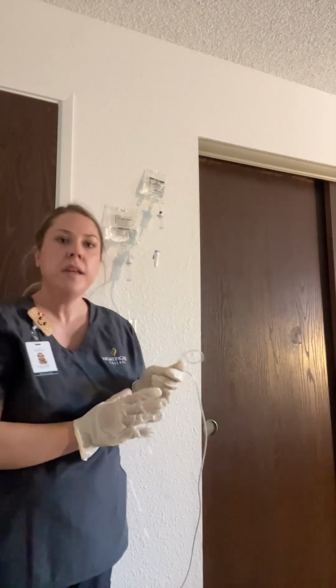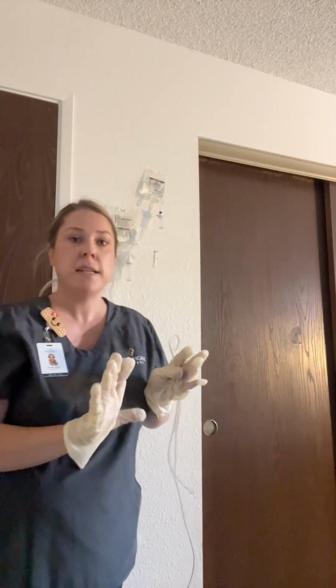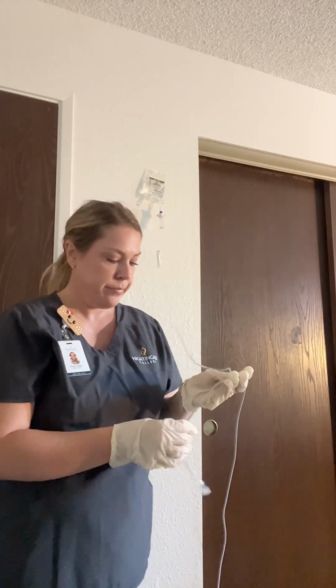Okay. So once the patient's good, we'd want to make sure we assess the IV site to make sure there's no signs of infiltration, redness, swelling, anything like that. We also want to make sure that our patient is comfortable. Again, ask them any questions.